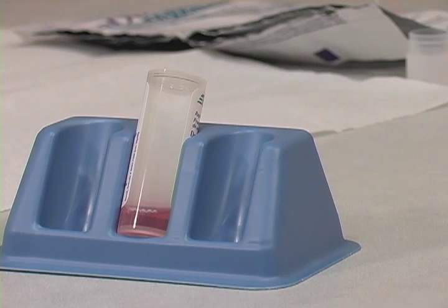Check the solution to make sure it appears pink. This means that the blood was correctly mixed into the solution. If the solution is not pink, discard all test materials in a biohazard waste container. Start the test over using a new pouch and a new blood sample.